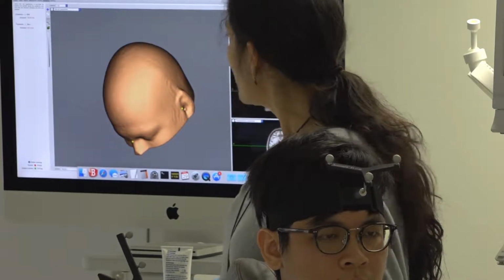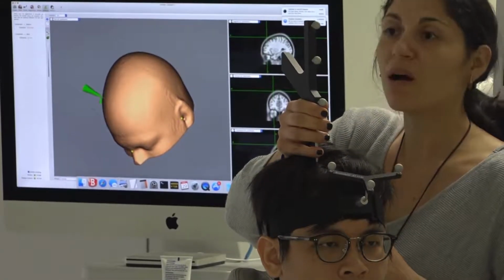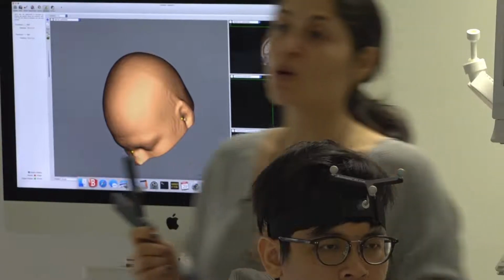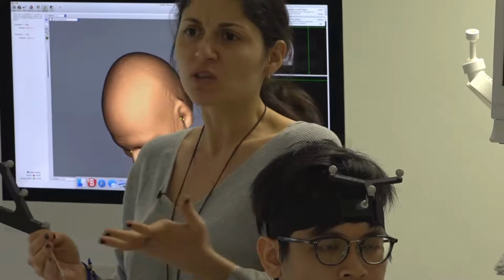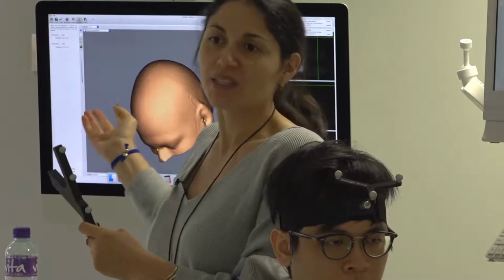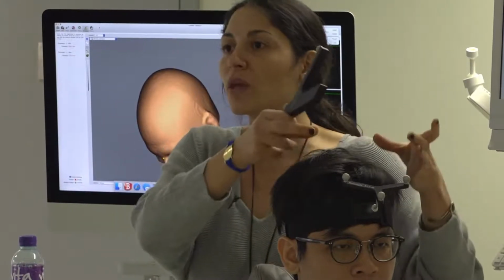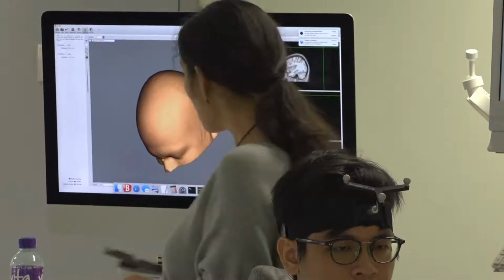So validation, and hopefully we'll get a nice green. You see, green means that we are in an acceptable range. So actually the registration was correct, which means it is equivalent. Obviously, when you are working with a generic brain and you don't have access to the MRI, it will not be exact, right? But it's fine, because you don't need it for real simulation. When you use it just for motor cortex and to know where the coil is, it will work when you are doing your real experiment. So that is important, yeah?